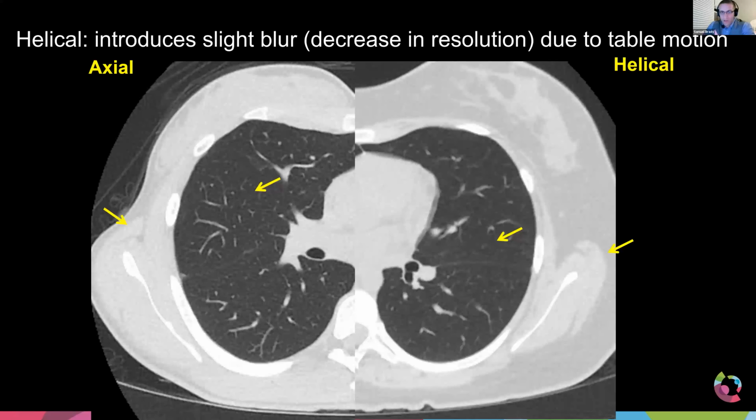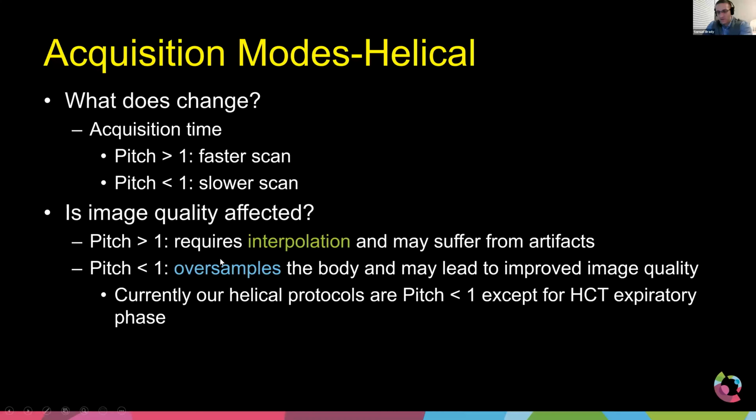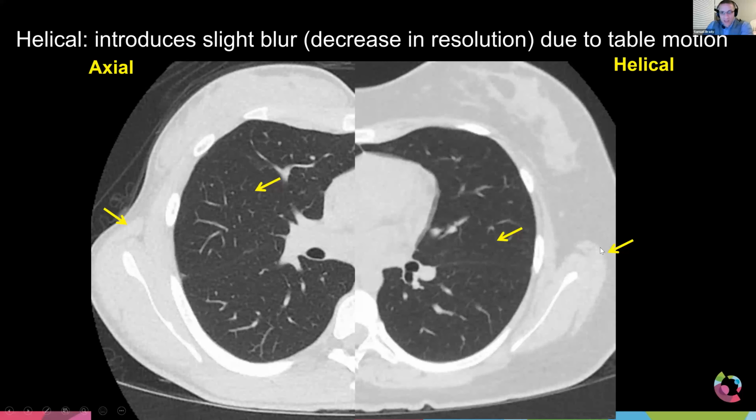Now, globally, helical imaging will always introduce a slight amount of blur in the image. So obviously here in the lungs, there's potential blur just because they may not hold their breath or the heart is moving, right? But if you actually look at the texture of the lung in this pretty good breath hold compared to the texture over here, and even look at the edges of the muscle and soft tissue and fat boundaries, they're stronger or sharper in the axial. And that is because, why?